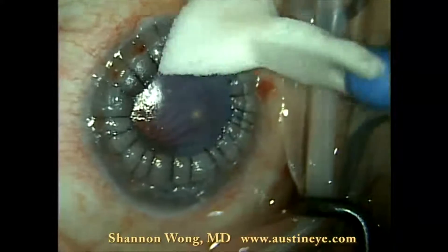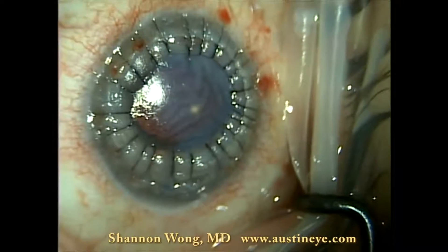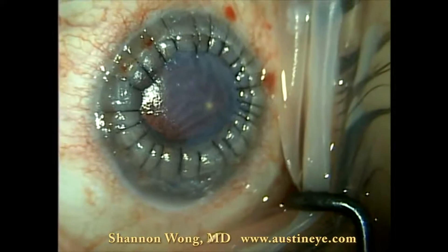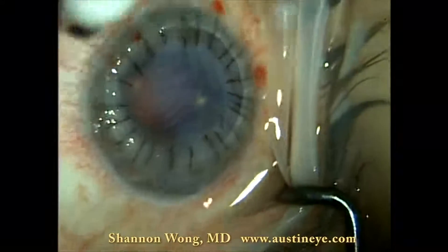This patient did spectacularly, remaining still using just intraocular lidocaine, topical anesthetic, and oral Valium.